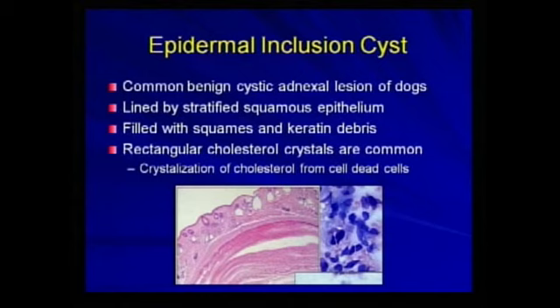epidermal inclusion cysts. Sometimes these are very difficult to differentiate from keratin-producing neoplasms, such as trichoepitheliomas, trichofolliculomas and infundibular keratinizing acanthomas.